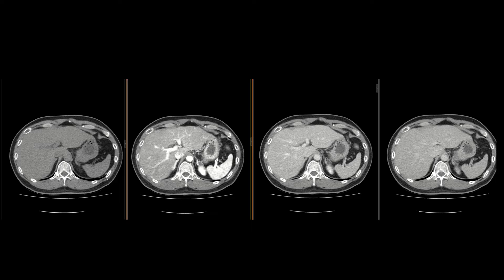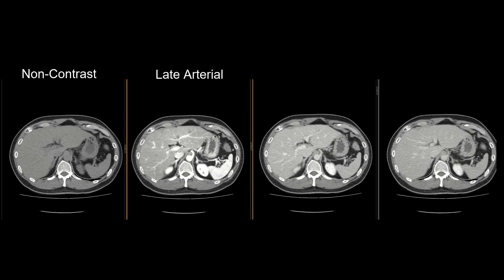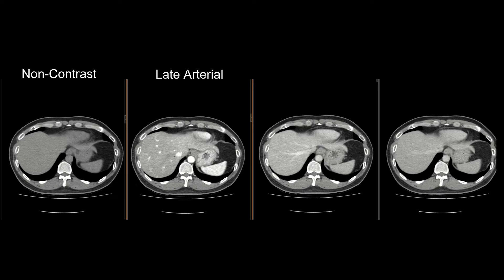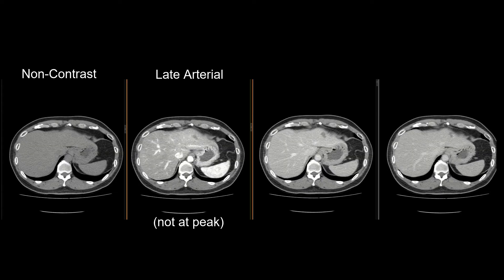Here are the four phases. One, on the left, a non-contrast acquisition before IV contrast was given. Two, we have a late arterial phase acquisition around 35 seconds after injection, with the arteries opacified and the portal vein opacified, but not yet the hepatic veins. Notice that the background liver doesn't enhance that much — remember, most of the supply is portal venous.